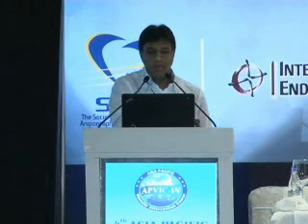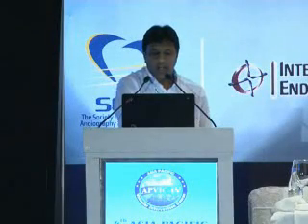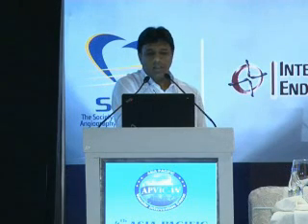This is the pictorial presentation of what I have told. Once we see free flow through this needle, only then can we be sure that our needle tip is inside the lumen. The equipment for the intervention is sheath, guide wires, balloon, and stents. These are the different types and sizes of sheath. The vascular sheath allows for easy exchange and introduction of the catheter and guide wire.